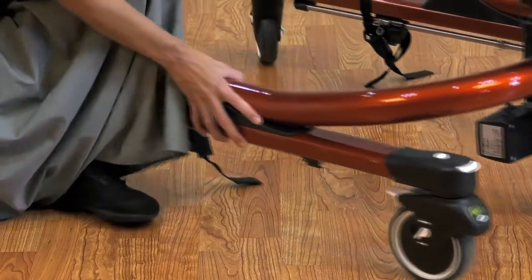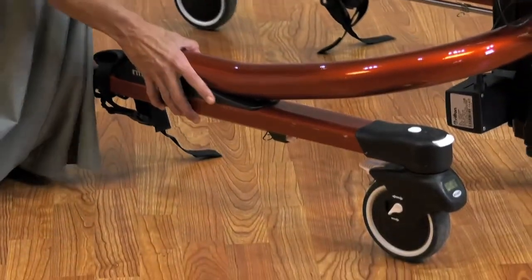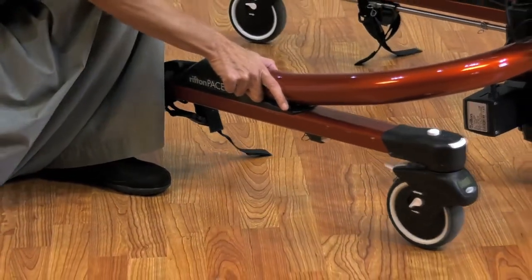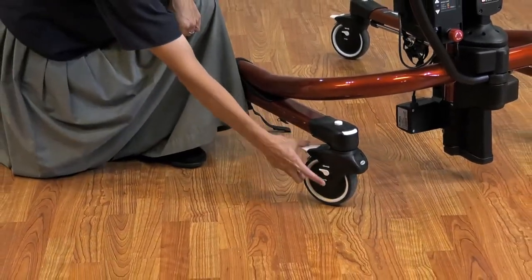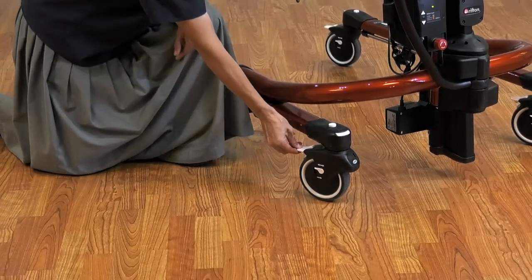The forward-only direction lock allows you to go forward but not backward, and it has that clicking sound. If you have the swivel lock released, you will be able to go backward and you'll still have that clicking sound, so be sure to use that in combination with the swivel lock. And then there's the brake.